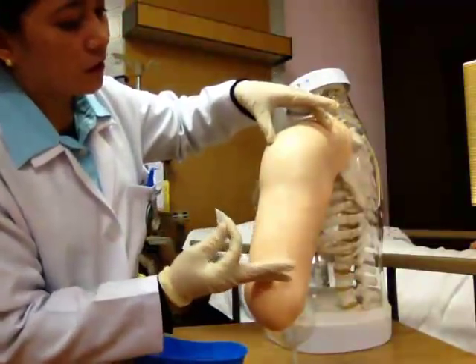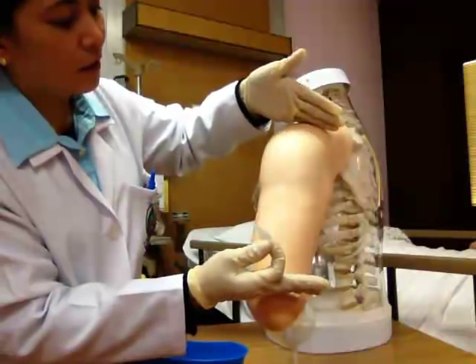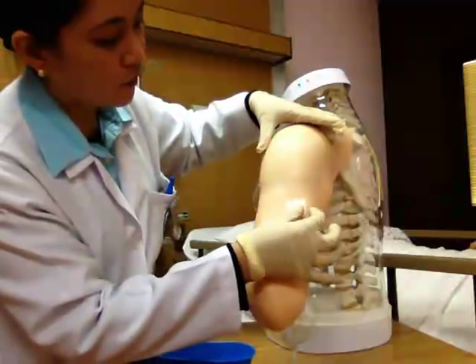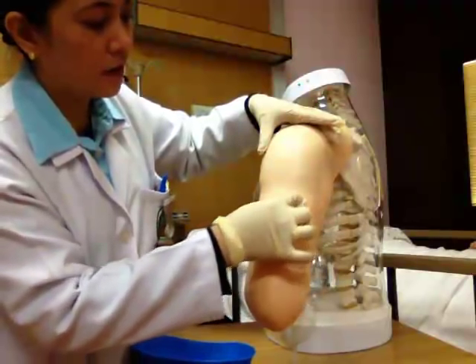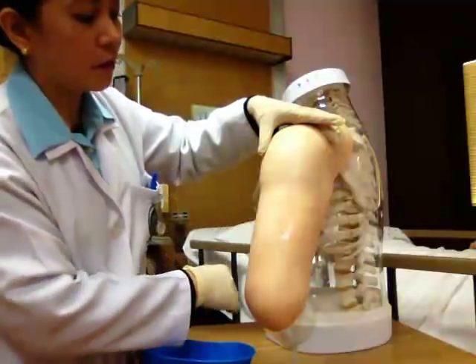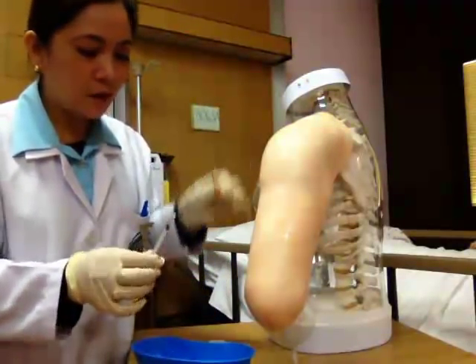The correct location of our injection site is the upper two-thirds of the lateral side of the arm, which we're going to do here. In a rotating and circular manner, cleanse or prep the area or injection site about 1 to 2 inches in diameter.